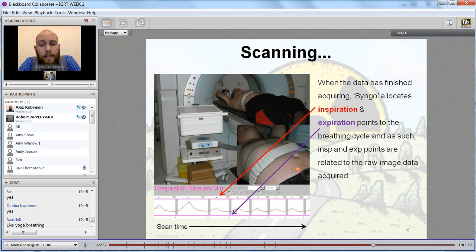One of the other things that we used to do in Leeds for the odd patient, due to their BMI, essentially when we couldn't get the data from our 4D scan, was that we would take them across to the LINAC and do a 4D XVI just to show the tumor motion, to see what its maximum sup-inf position is, what its maximum in lateral and post, and so on and so forth. Then we'd just replicate this on a conventional CT, so that our PTV, ITV is more focused around the patient rather than historic repopulated data.